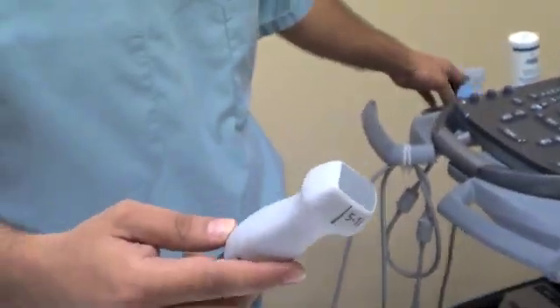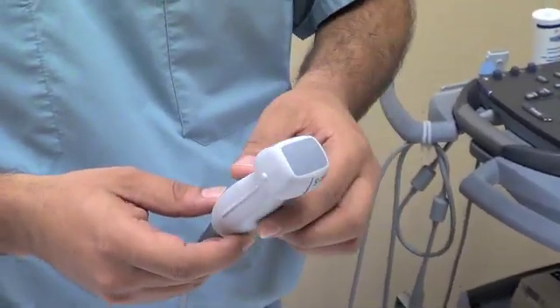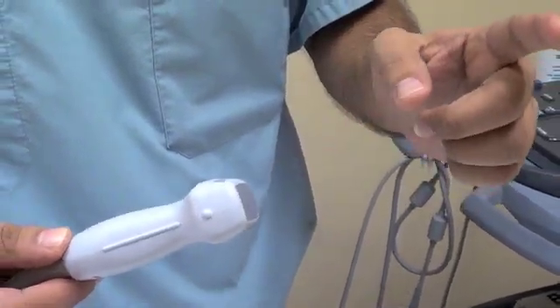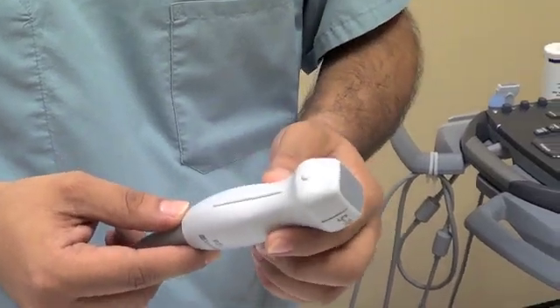This probe is called a cardiac probe, or a phased array probe, and you can see it has a more square and rounded appearance. It transmits ultrasound images to a much greater depth, and the advantage of this is you can actually see the heart, abdomen, and deeper structures in the body.